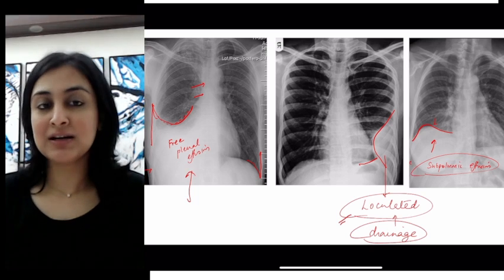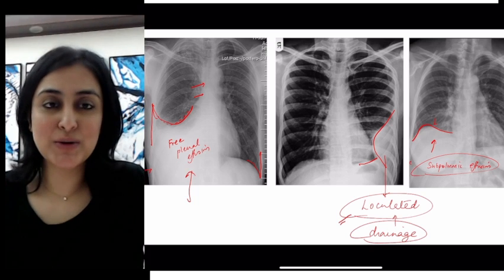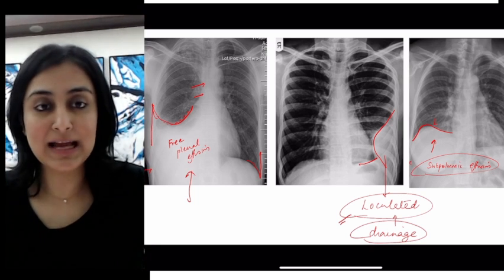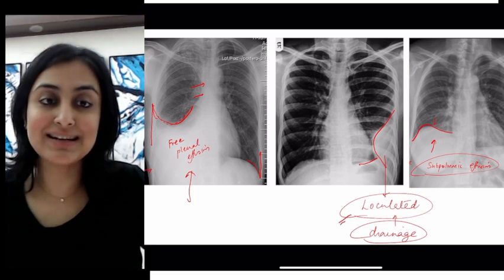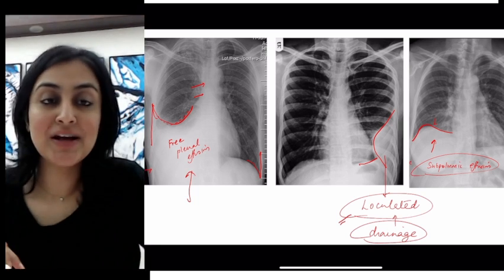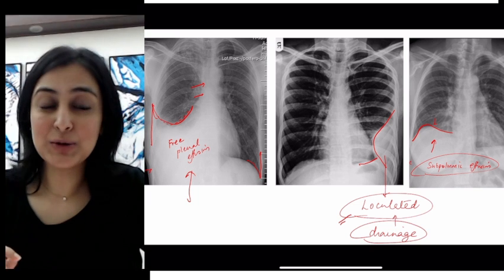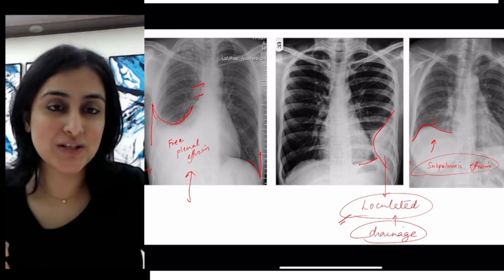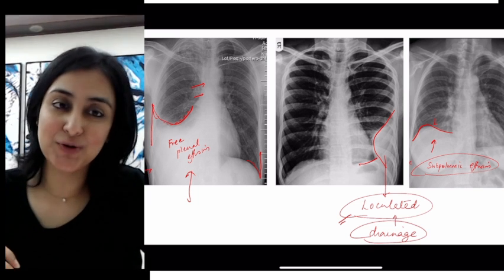So these were the must-know images about the types of pleural effusion and their diagnosis on radiograph: free pleural effusion, loculated pleural effusion with adhesions, and sub-pulmonic effusion where the diaphragm appears raised with lateral dome displacement. I hope this is useful and I will see you all soon with the next one. Thank you.